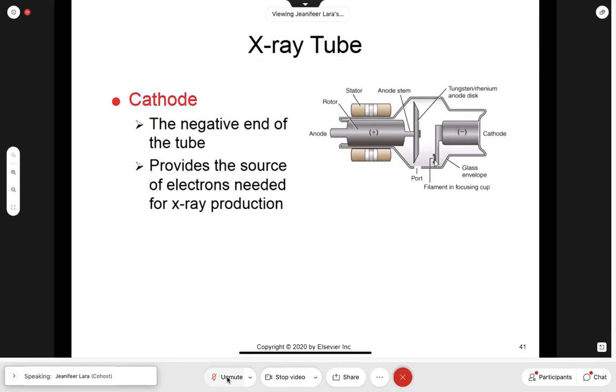Well, what happens when we're ready to release those electrons? What do I need to do to the anode? Yes, it's spinning. Yes, the mechanicals are spinning, but what do I need now to apply to this anode to create kinetic energy of the electrons? It has to be energized. And we're going to later say that's kVp. Right now, I don't care, not for this test. Got it? Good. What do we call that when electrons are now moving?